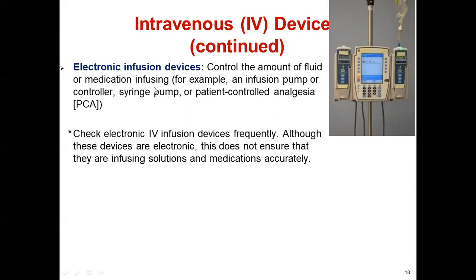So check the electronic IV infusion device frequently. As an RN, we have to check it. Although these devices are electronic, this does not ensure that they infuse solution and medication accurately.